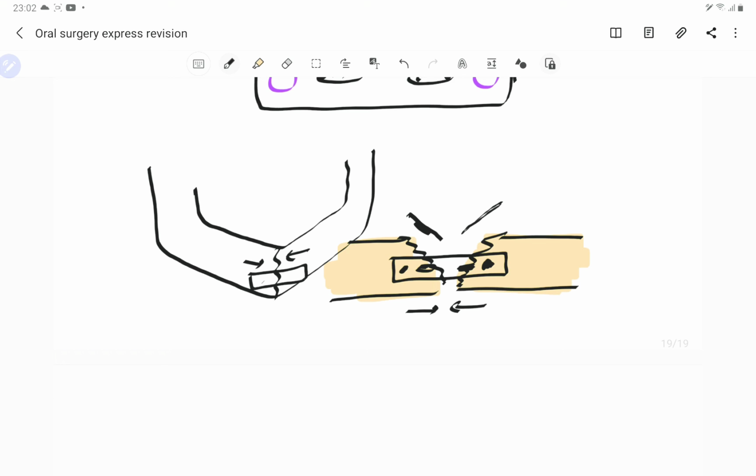This is what we call the release of tension. So there is a compression and tension, and because of that the superior border of the mandible opens up. So we need to put either one plate over here, or one screw over here, so that the fragments do not get apart at the superior border.